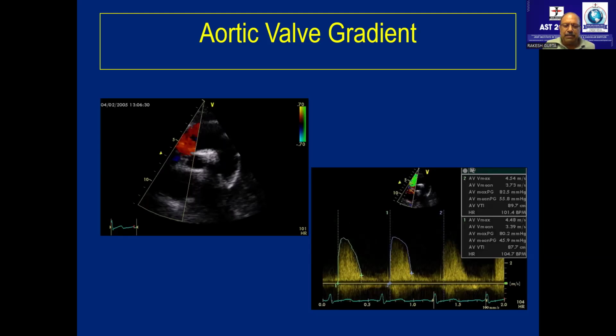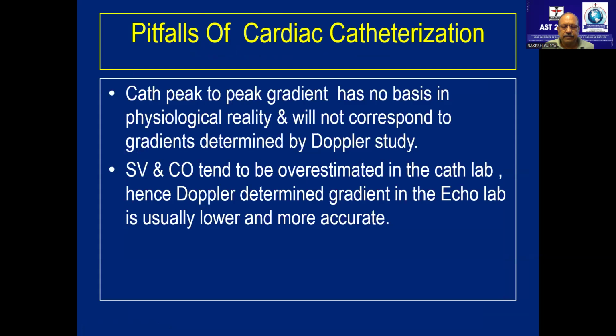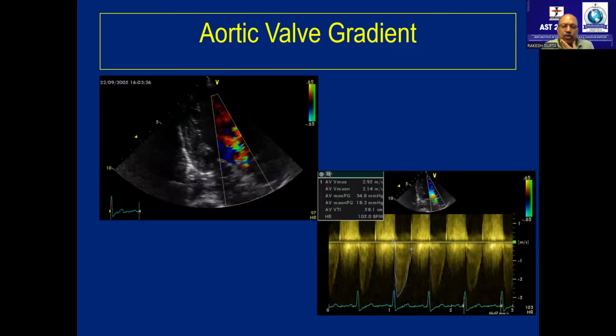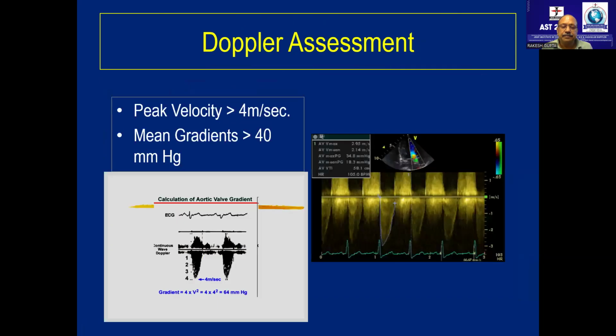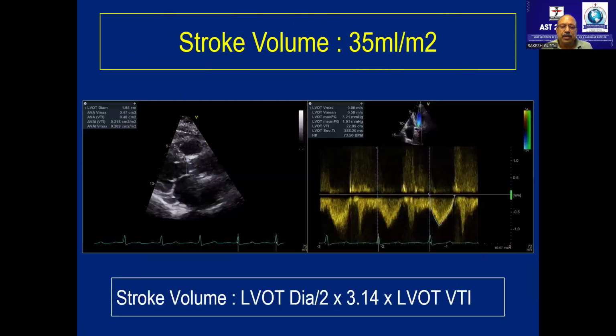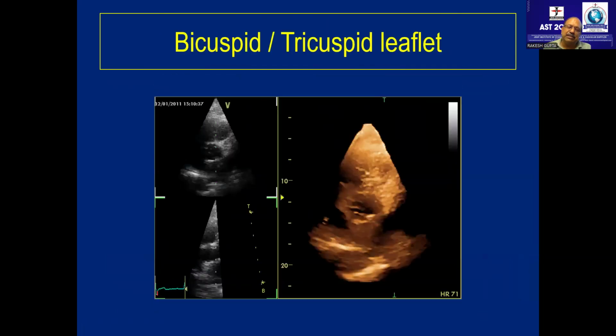So I'm done with the aortic valve. Anything somebody would like to ask about the aortic valve? Sir, sometimes the valve is bicuspid, but in diastole it will appear like three cusps. Always look at the opening of the valve, not the closing of the valve. Closing will look the same. It's the opened valve which looks bicuspid or tricuspid.